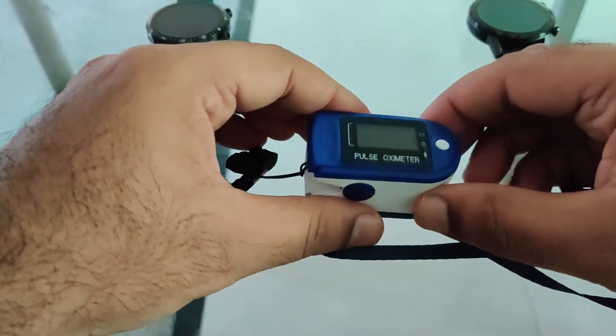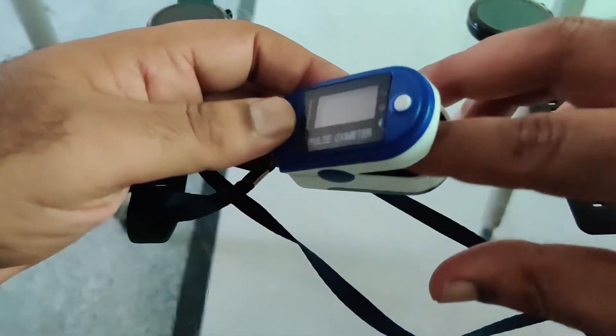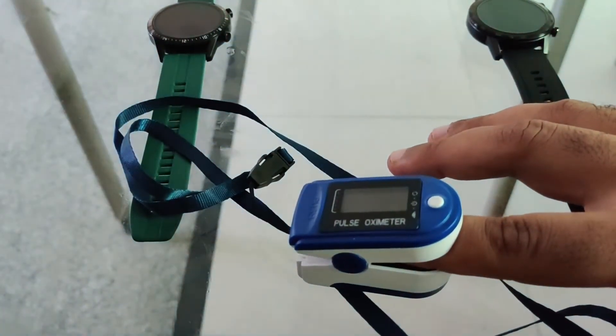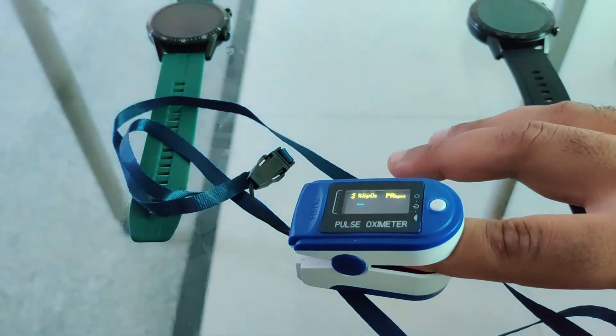The first in the list is a finger type pulse oximeter. These devices measure the oxygen saturated hemoglobin relative to the total hemoglobin in the blood. So let's quickly measure my oxygen level as well as the pulse.